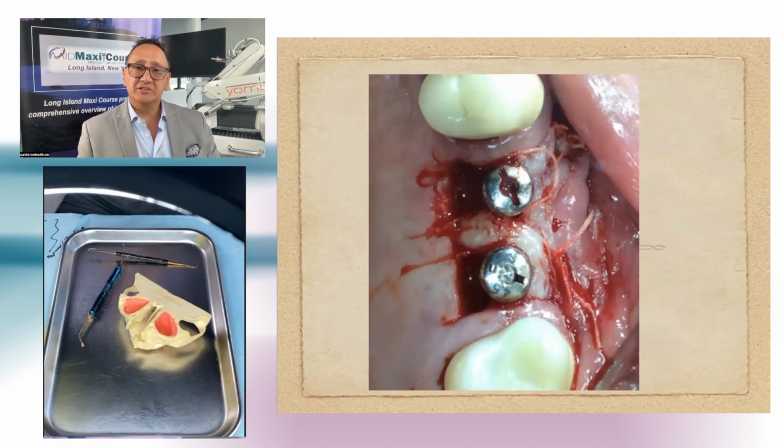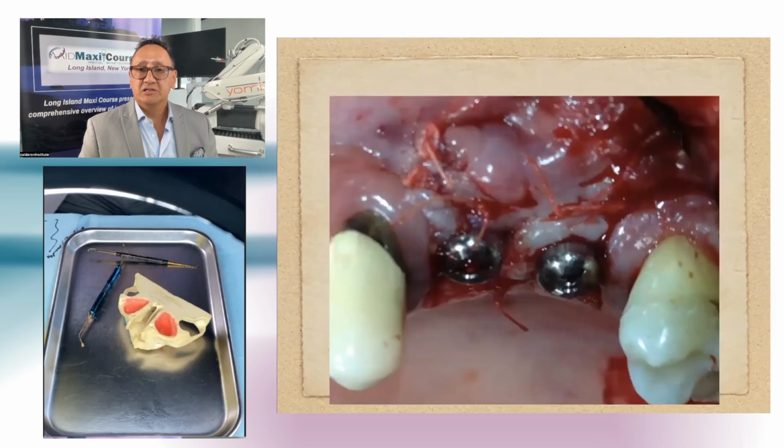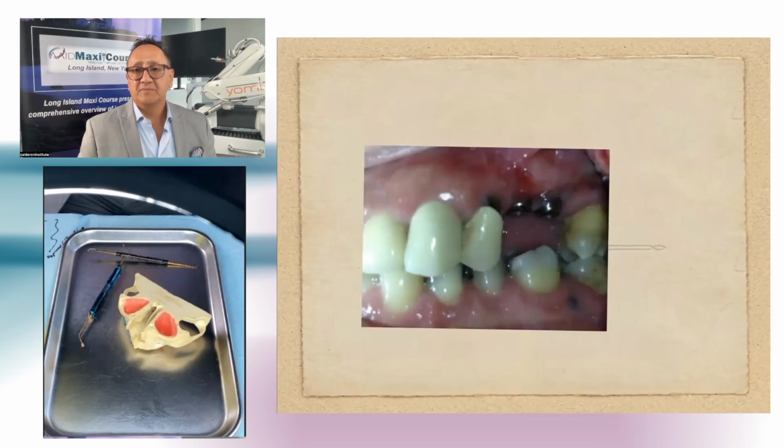Now, lingual to those implants or palatal to those implants, that's going to heal by secondary intention, meaning that there's no primary closure there. The papilla in between the implants is going to form by me passing the connective tissue. That's the way it looks. It looks really like a hamburger, but it does heal. We have to just keep an eye on the patient, and that's where it's healing.